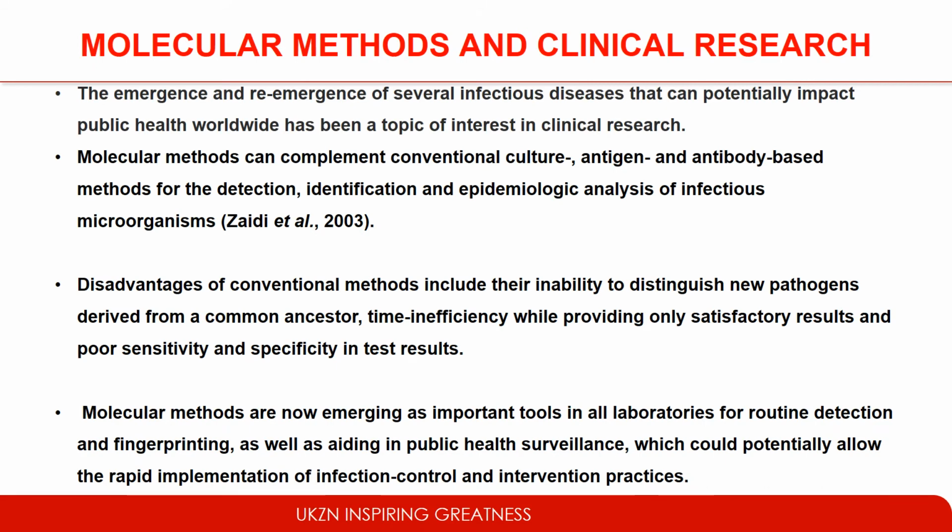So let's move on to the crux of this presentation, which is molecular methods and clinical research. The emergence and re-emergence of several infectious diseases can potentially impact public health worldwide, and this has become a topic of particular interest in clinical research. Molecular methods can complement conventional culture, antigen and antibody-based methods for the detection, identification, and epidemiological analysis of infectious microorganisms.